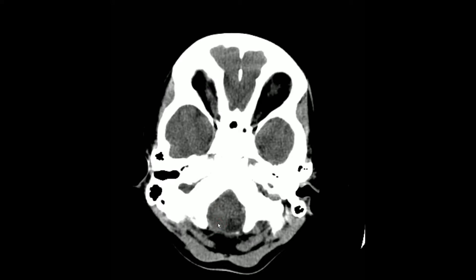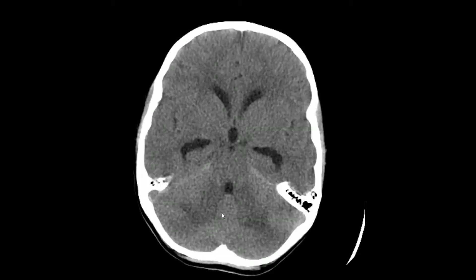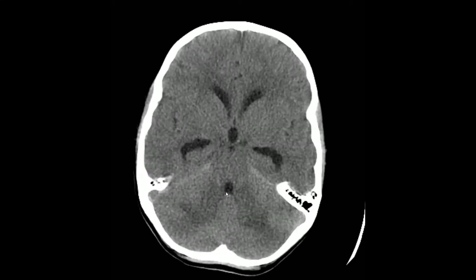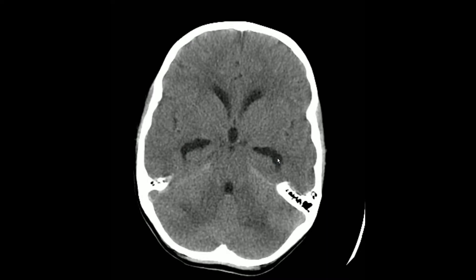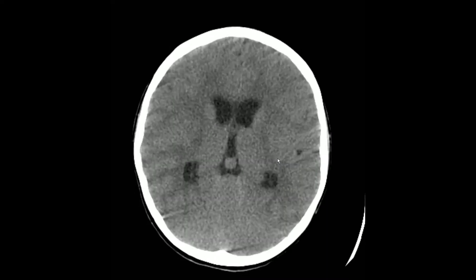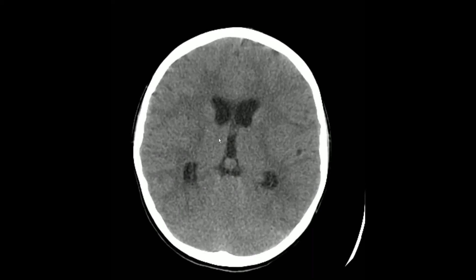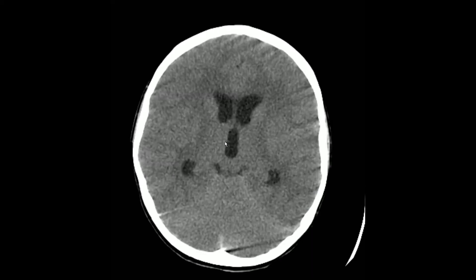At the foramen magnum, there also are findings of obstructive hydrocephalus with abnormal rounding of the temporal horns and more diffuse enlargement of the lateral ventricles and the third ventricle.